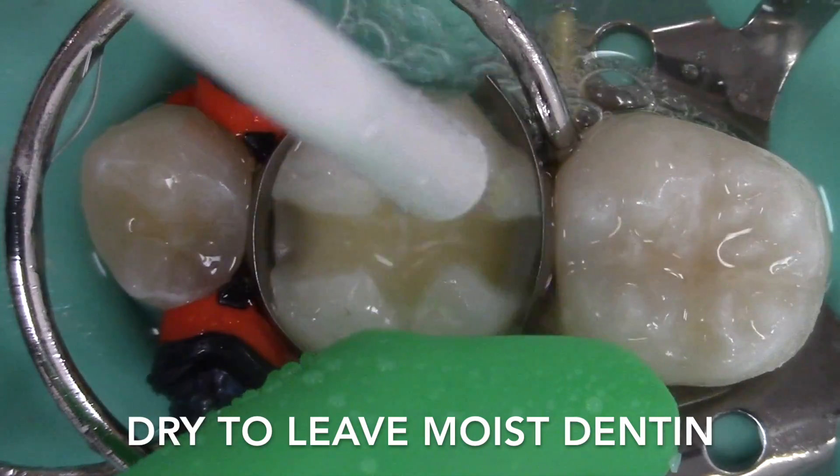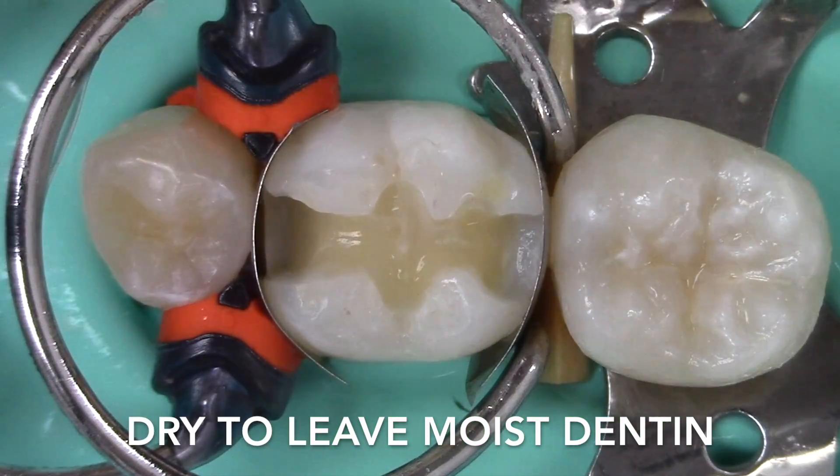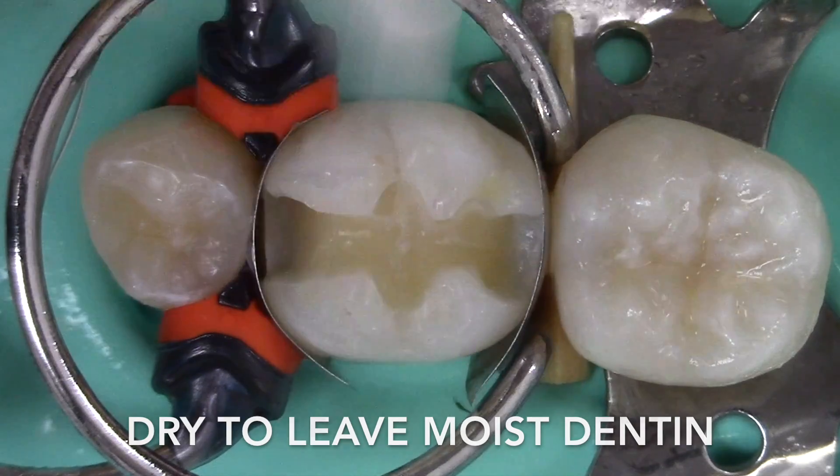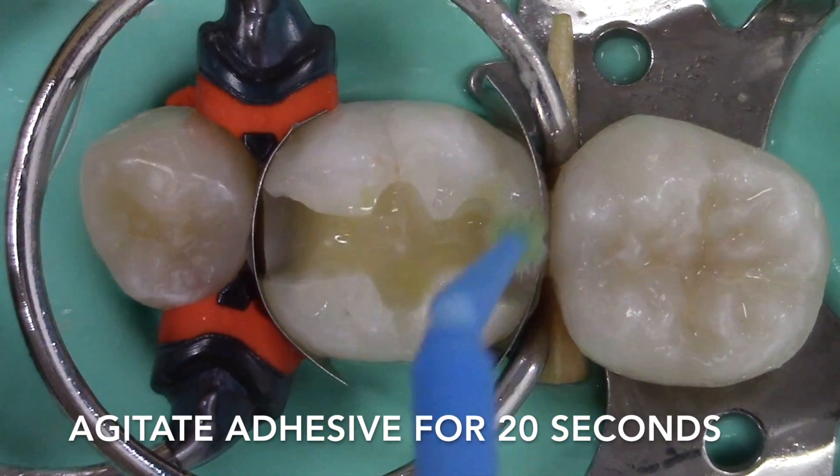The dentin is then air dried to leave a moist surface. It's important not to over dry the dentin, particularly in the total etch mode, as it may prevent the formation of a hybrid layer. Adhesive is applied to the preparation for 20 seconds.